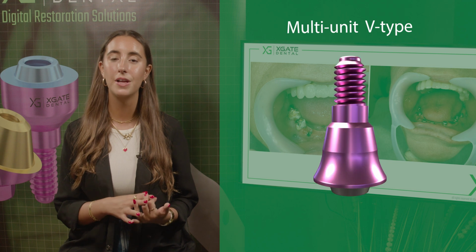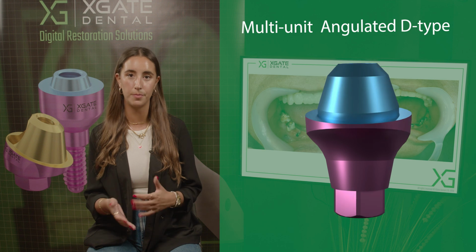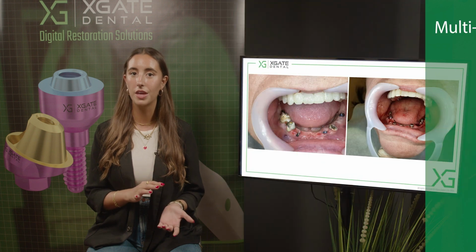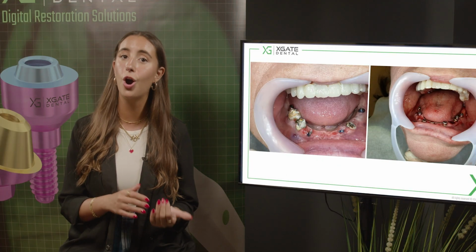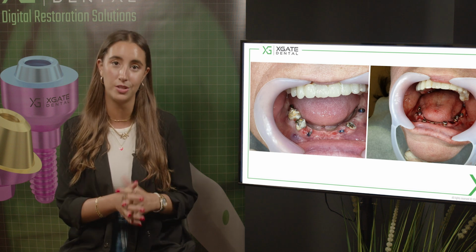Now we placed the implants on the lower mandible in 2 steps. The first step, we took off the bridge and we placed about 4 to 5 implants. And you can see that we have an implant around the second molar. We have an implant around both canines and around the second premolar and second molar also, and we returned the PFM bridge that she had before, and we gave those implants some time to osseointegrate.